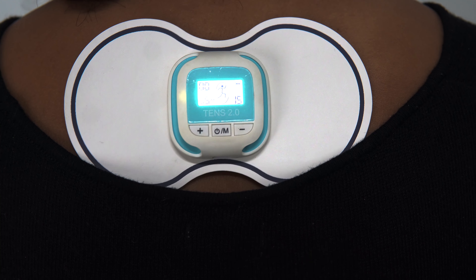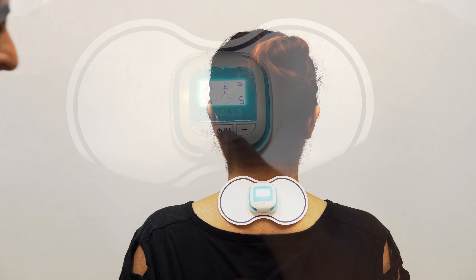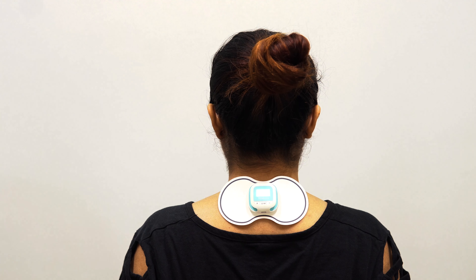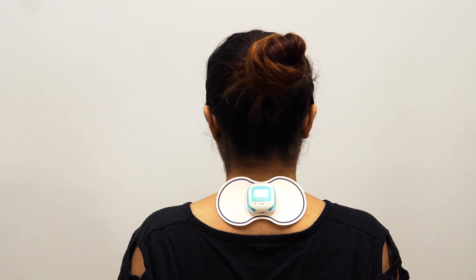You can ask the user whether they are able to tolerate the intensity of the current or not, and depending on that you can increase or decrease the intensity. Once set, the patient just needs to sit and relax and take the help of TENS therapy to achieve pain relief.